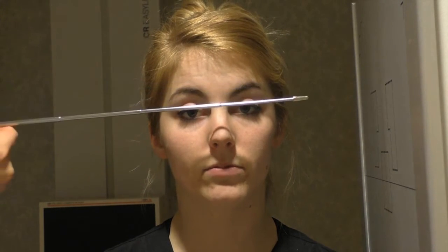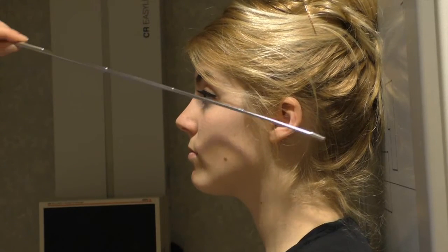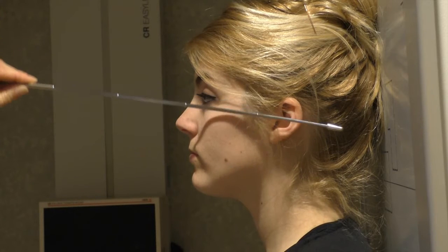Here is a reminder of the basic body planes, landmarks, and cranial positioning lines used in basic skull positioning. The first one is the mid-sagittal plane, the IPL, the glabella, nasion, and mandibular symphysis. The OML, the IOML, and the inion.